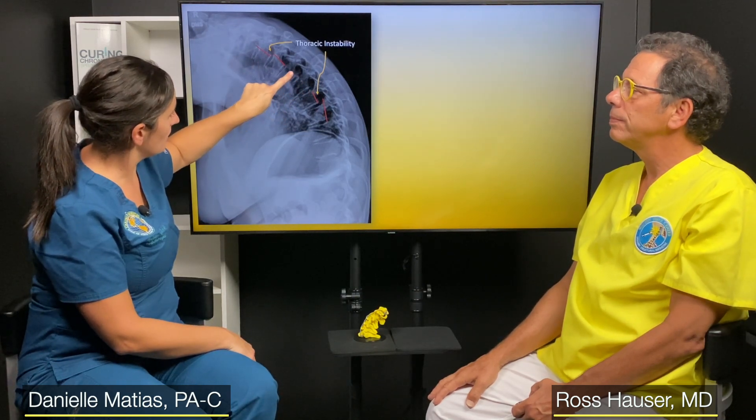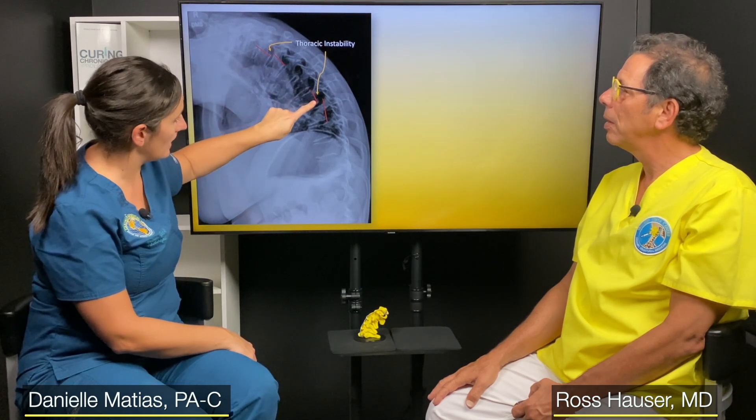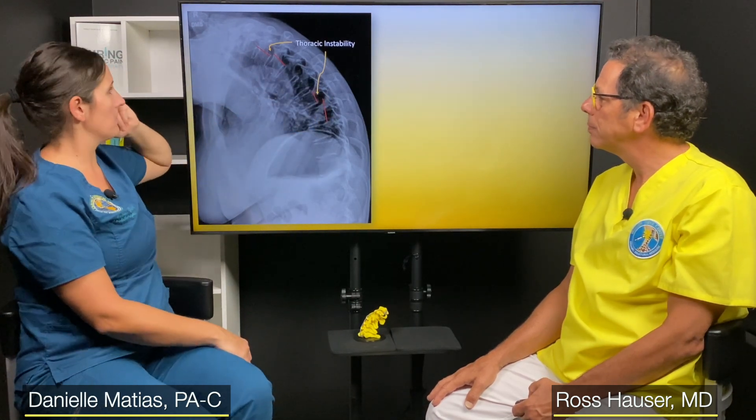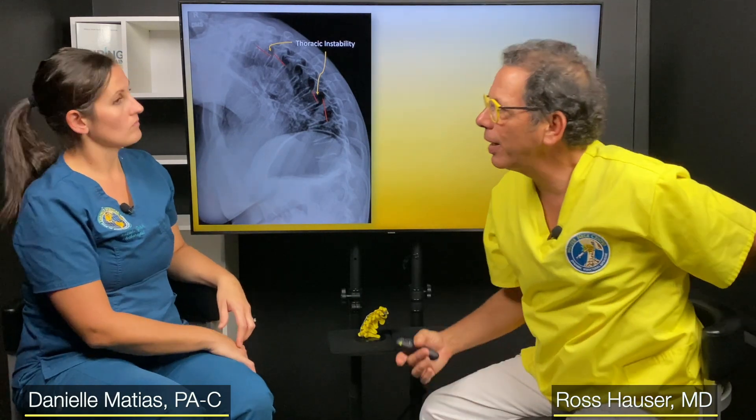We're looking at whether the person has instability — are ligament injuries causing their pain? You should be able to draw a line through the back of all these vertebrae, and here there's a stair step, and again here there's a stair step. That might be at the thoracolumbar junction where there's actually instability, and we check whether that correlates to the patient's symptoms. This particular patient would have pain here and here — they probably notice a clicking when they move. It turns out it isn't the whole spine that's unstable, just a few areas.